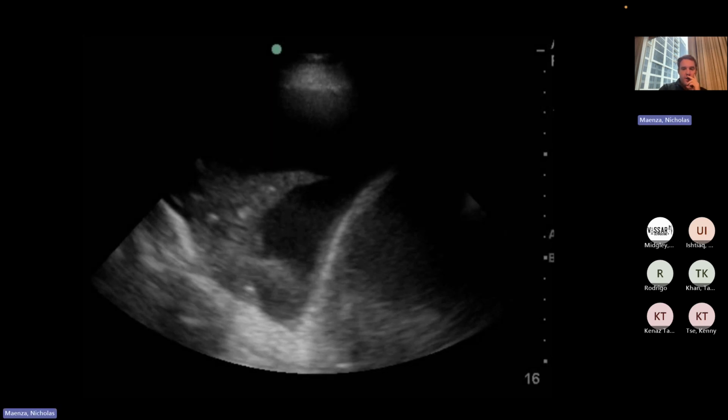And say the patient's pulmonary edema went from really bad and it continued, and they can eventually get a pleural effusion. So say you're looking at that posterior lateral view, or you're almost doing your FAST view where you're looking above the diaphragm. At that point, you can get fluid around the lung. So you're doing that posterior lateral view, and instead of seeing rib with that little visceral and parietal pleura up there, you see this whole fluid, and that's compressing that lung right there.